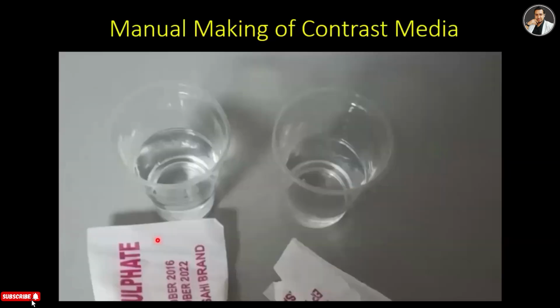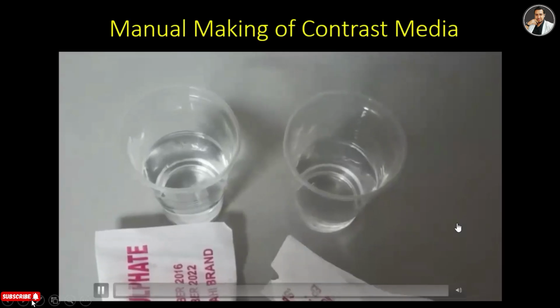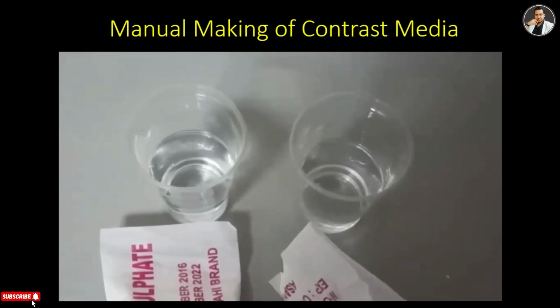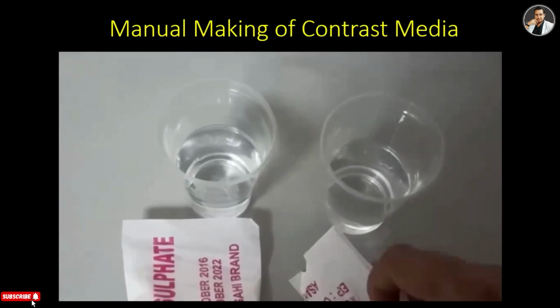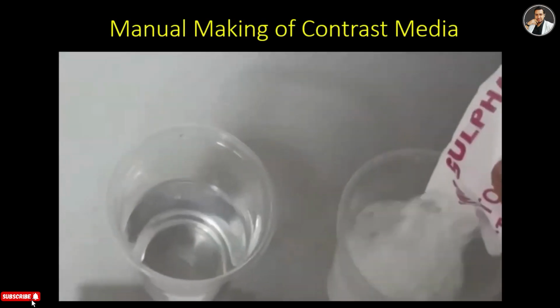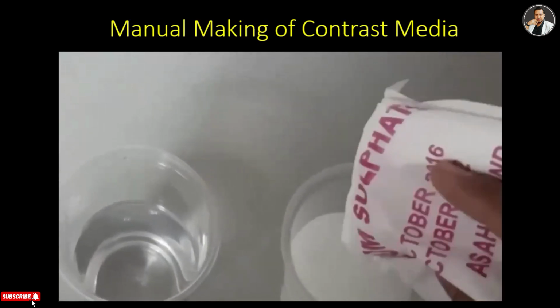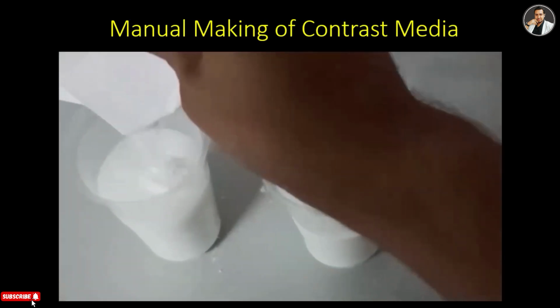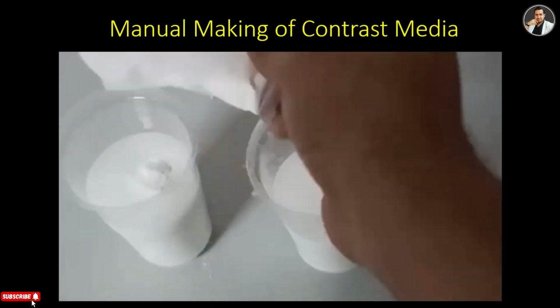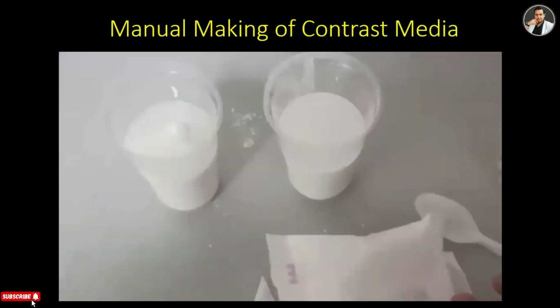If you don't have the ready-made solution available, you can make it manually. You can make barium solution manually like this. Here I take 2 glasses, and first I fill the glasses halfway, and then pour 100 gram of barium sulfate powder in each glass. So 2 glasses total have 500 milliliter of solution.